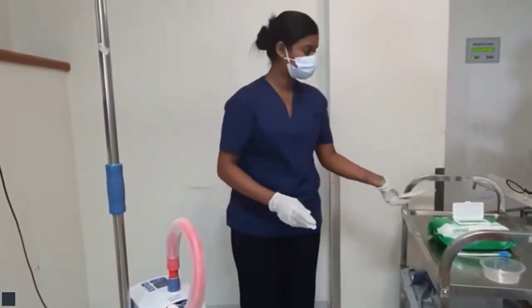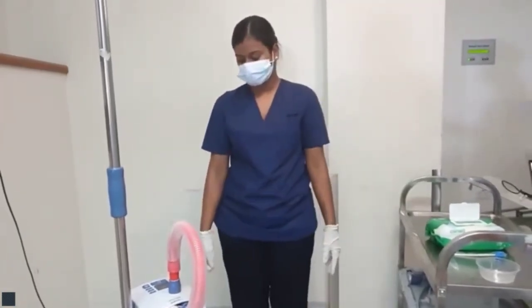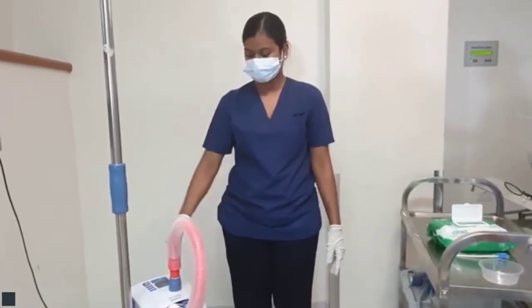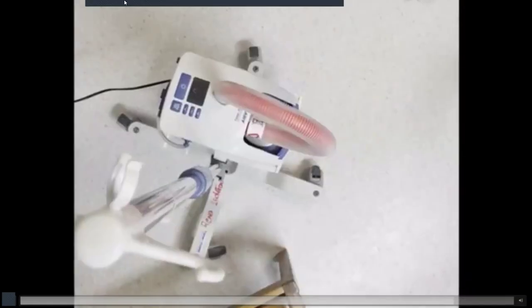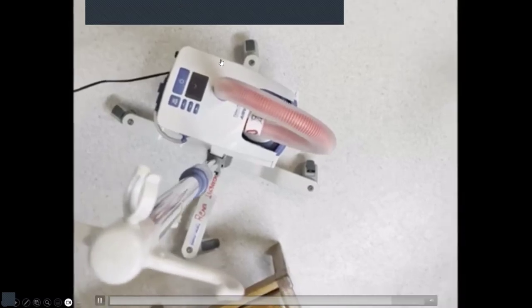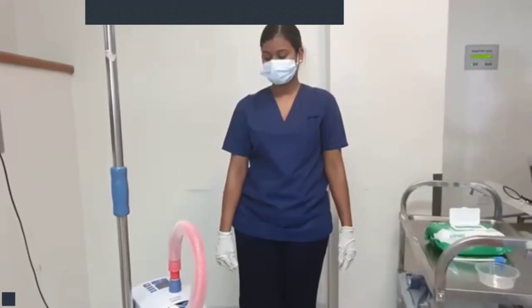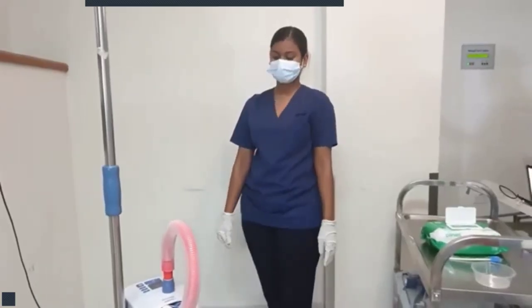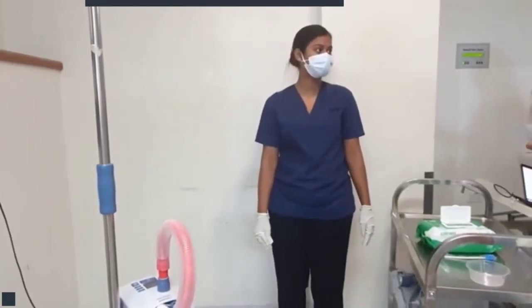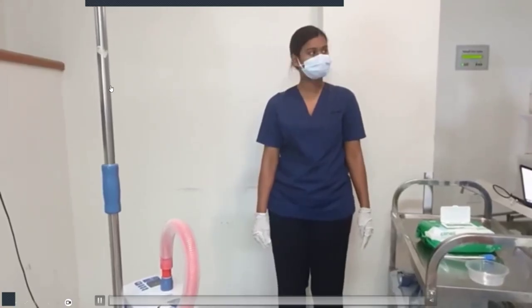Once we've connected the disinfectant tube, the The machine will now automatically start the disinfecting cycle, which takes about 55 minutes. Again, if any problem occurs and the machine stops disinfecting, you can always restart the cycle. And if the machine keeps stopping repeatedly, we can always notify the biomed technician. So once the disinfection is successfully completed, it will show the disinfectant cycle.